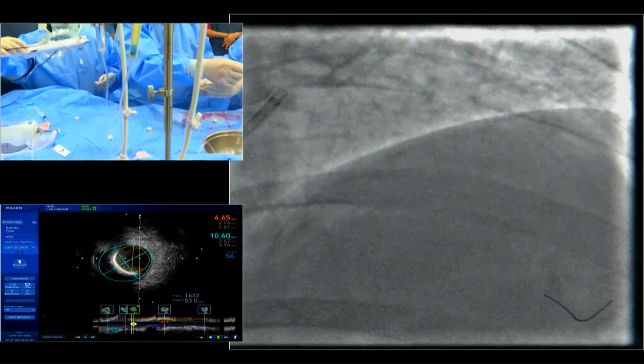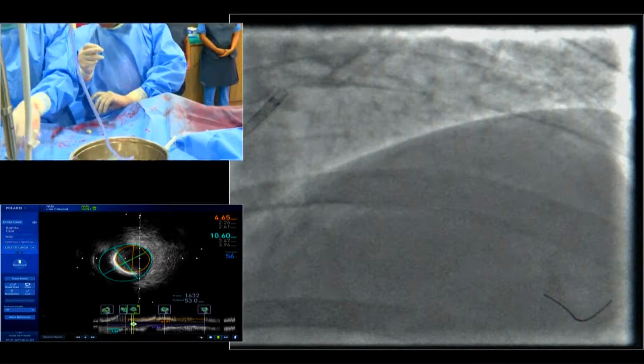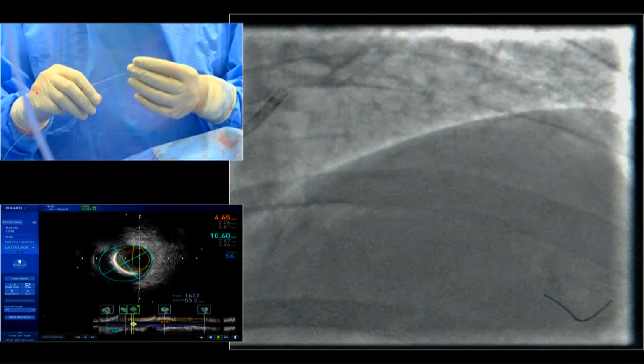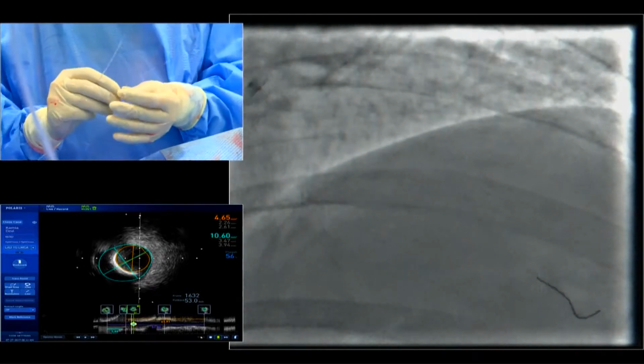So this is a 1.75 bar, and we will go only the proximal part of the LAD. I won't go very distally. Only the ostium I want to clear it. That's it. I will not go distally inside the LAD.